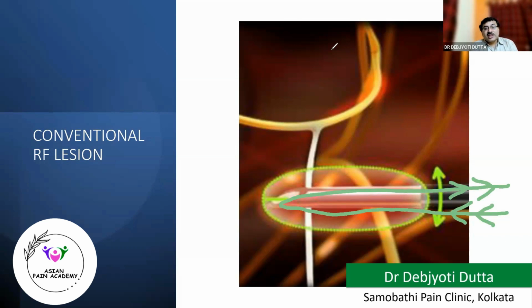But in that condition, the equilibrium will be slightly different. As the tissues close to the needle are not going beyond 90 degrees Celsius, the equilibrium that will be formed will be a little bit different. So what type of equilibrium will it form? Let me draw it for you. It will form a different type of equilibrium. Say, as we are flowing cold water through this channel, the tissues close to the needle will be at 50 degrees Celsius.